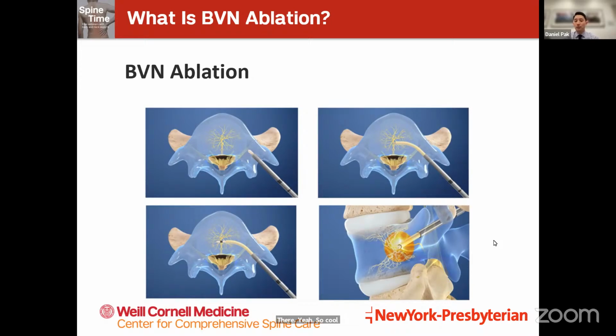Yeah, so complications, certainly we always review these with patients beforehand. There are complications inherent in the procedure itself. Getting into the spine, there's risk of bleeding, infection, and things like spinal cord or nerve injury are exceedingly rare. We do all of this under image guidance. Some of our interventional radiology folks, and Dr. Salama, sometimes use a CT guided approach. Some people will use fluoroscopy, which is X-ray if you're a pain physician. Those things are all there to mitigate the risks. There is careful patient selection, and we have indications and contraindications for people we think this works best for. Those things are all reviewed with the patient beforehand.